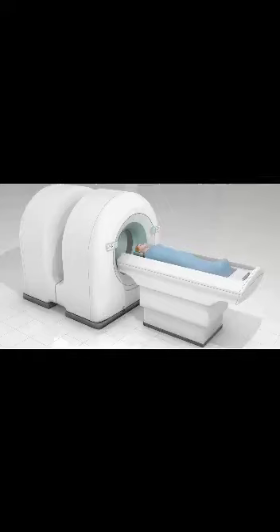Positron emission tomography, PET, scan is an imaging test that can help reveal the metabolic or biochemical function of your tissues and organs. The PET scan uses a radioactive drug, tracer, to show both normal and abnormal metabolic activity. What is a PET scan used to diagnose?